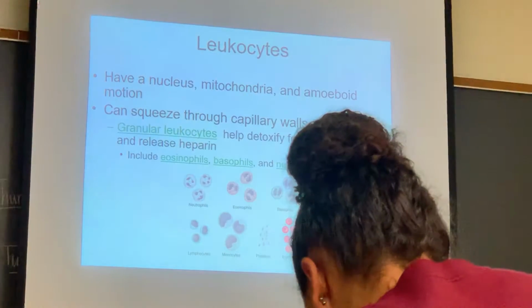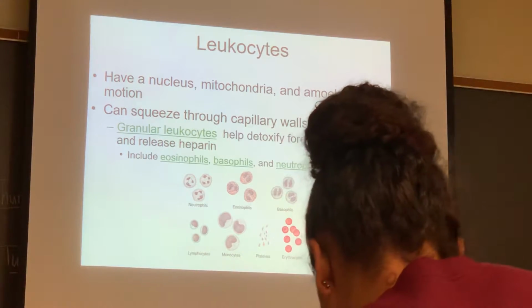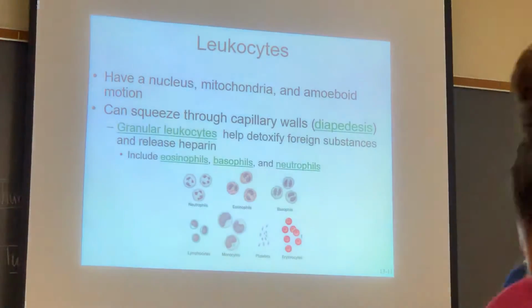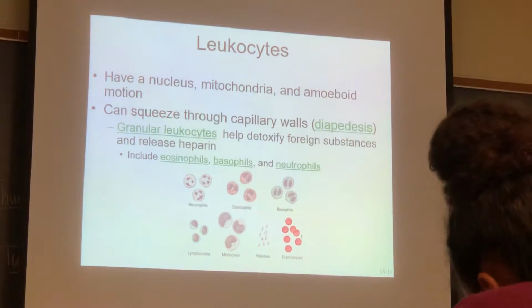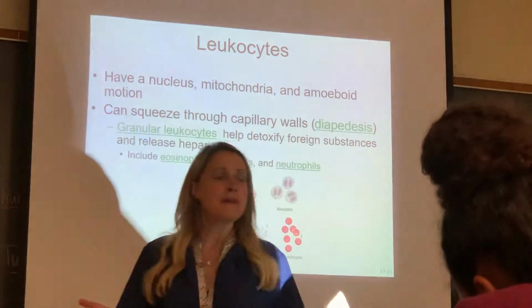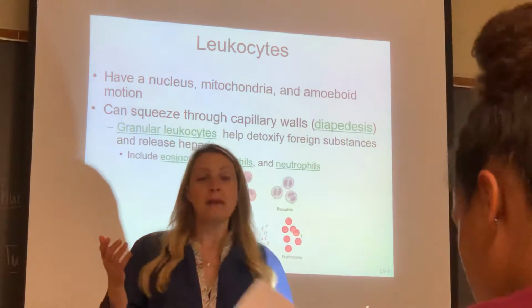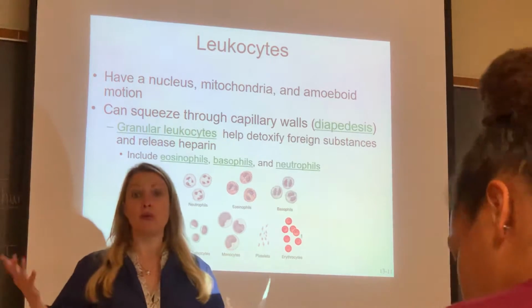identifying some of these white blood cells, looking at what they do in terms of the kinds of infections that they fight. So, for example, today we looked at just general white blood cell counts. Like, was it high, low? Just like with the red blood cell count, we also did hematocrit and hemoglobin for red blood cells, looking at our blood. But white blood cell counts tell us generally if we're high, low, or normal.